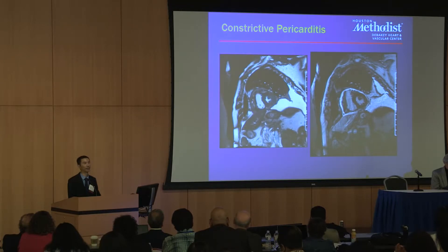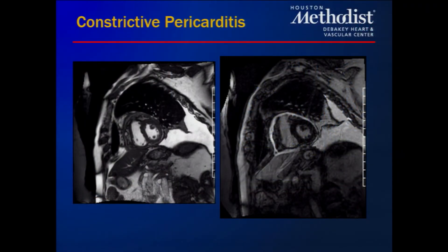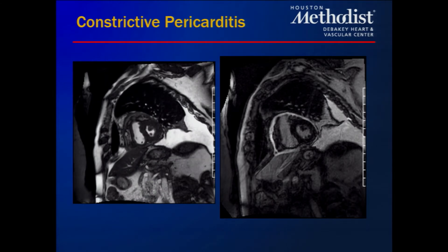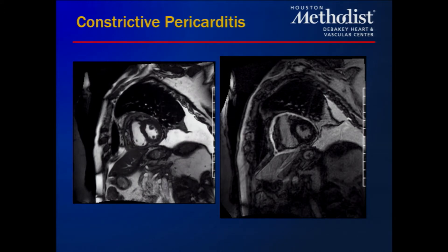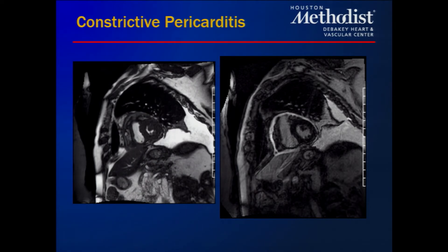Expanding on delayed enhancement, cardiac MRI also helps answer questions about pericarditis. Shown here is a patient with constrictive pericarditis where the cine demonstrates very increased thickening like a rind around the heart, and the late contrast image shows diffuse enhancement appearing as bright white, supporting that the pericardium is actively inflamed and leaky.